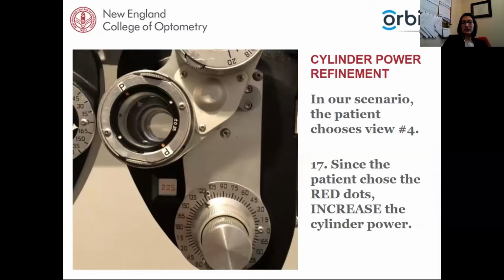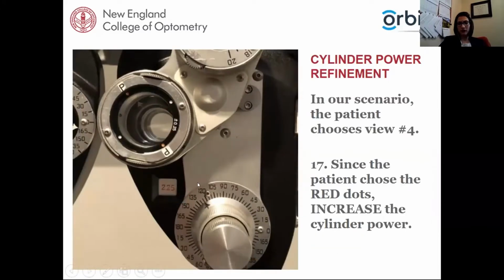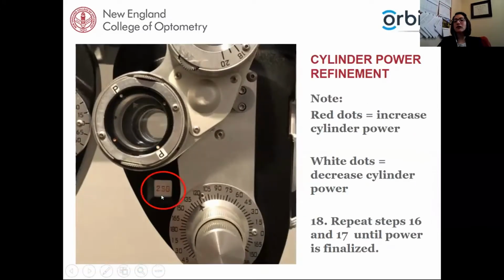So what we had discussed a little bit earlier was that if the patient chooses the red dots, you want to increase the cylinder power. If they choose the white dots, you want to decrease the cylinder power. So because they chose red, we want to increase the power by 1/4 diopter. So you'll see that we went from a power of 225 to now 250.